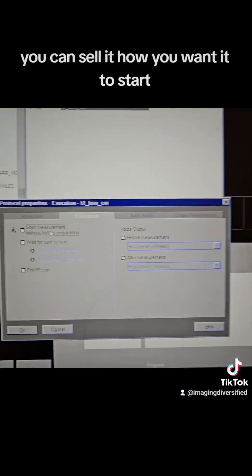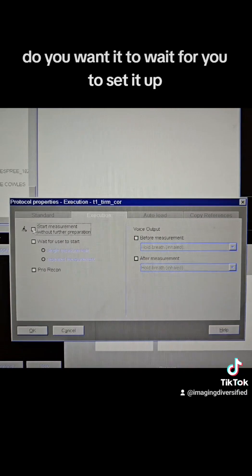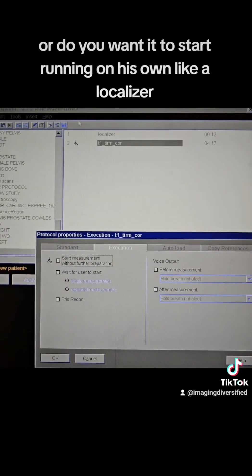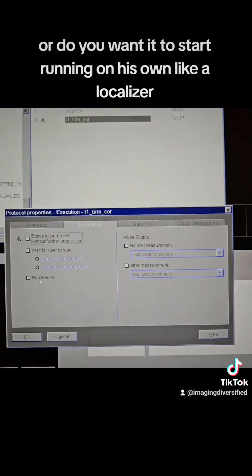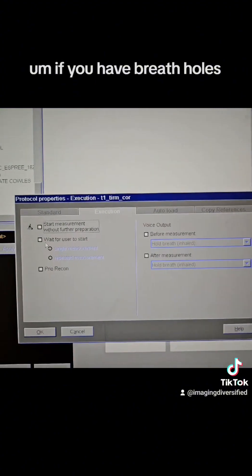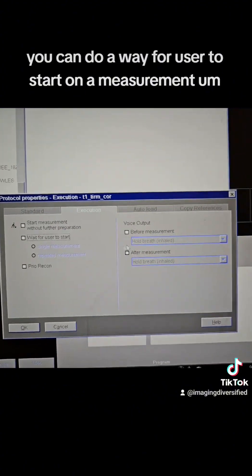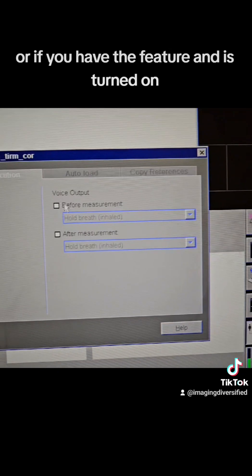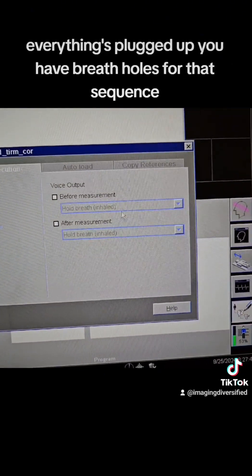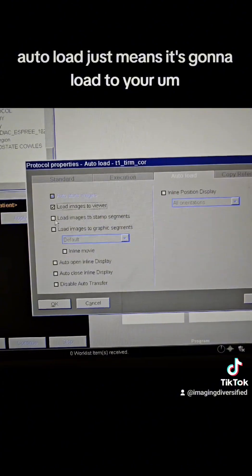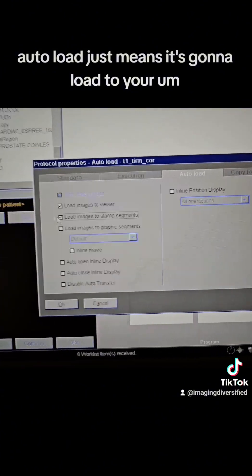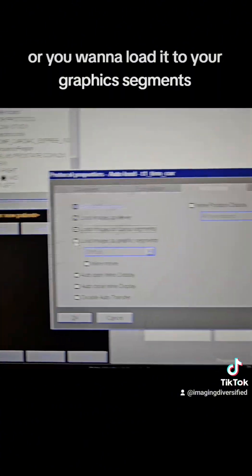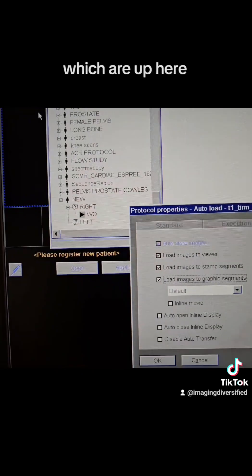You can tell it how you want it to start. Do you want it to wait for you to set it up, or do you want it to start running on its own like a localizer? If you have breath holds, you can do a wait for user to start on a measurement. Or if you have the feature and it's turned on, everything's plugged up, you'll have breath holds for that sequence. Auto-load just means it's going to load to your stamp segments, which are the little segments here, or you want to load it to your graphic segments, which are up here.